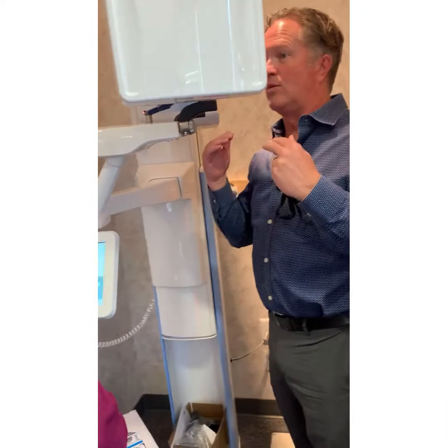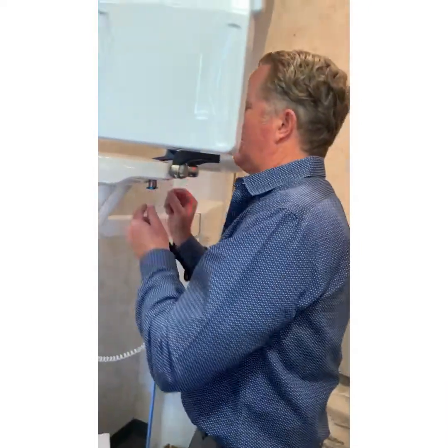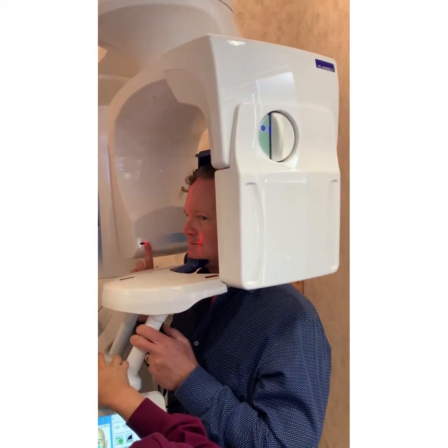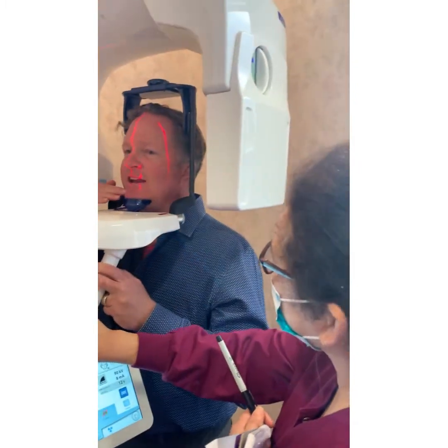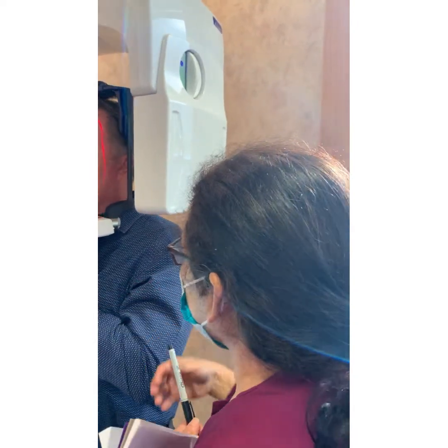I didn't realize there's some practice around here. If you need, let's say I'm raising the whole thing up. So you're gonna raise it up, but you're gonna lower the patient. Now go ahead and raise that. Use the arrow and raise the patient. Now where's the line? This line right here. Oh, that one? On the middle of your chin. Yeah, down low on the jaw. I'm not getting any anatomy below that line. I need it down here. Right. So you go under your jaw.